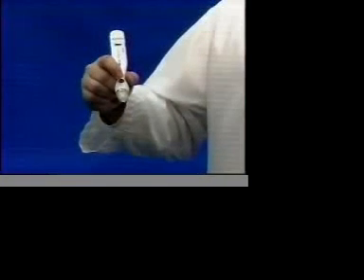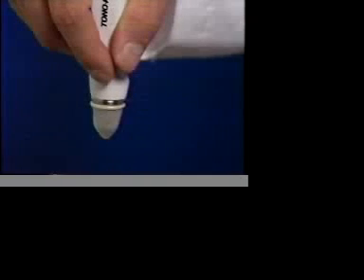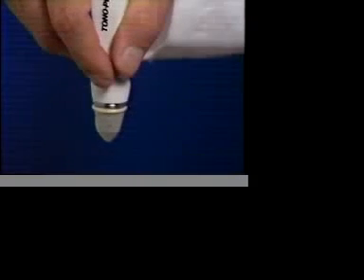Next, hold the TonoPen vertically with the tip down. Press the activation button twice in rapid succession to enter the calibration mode.